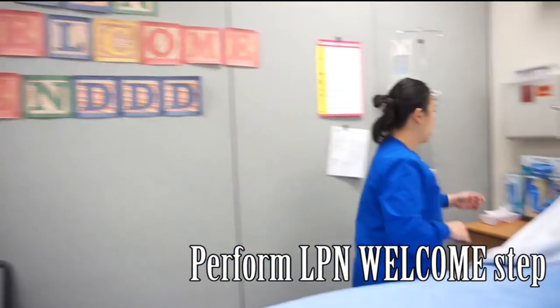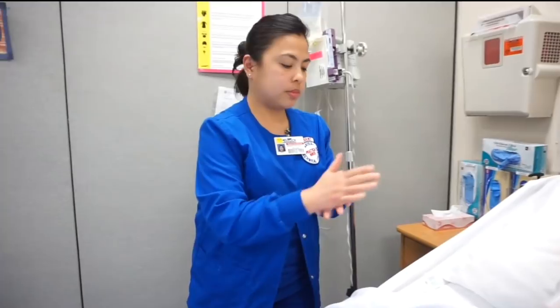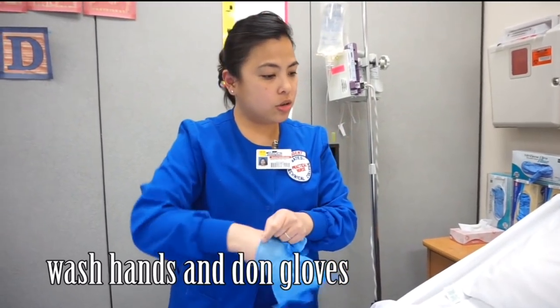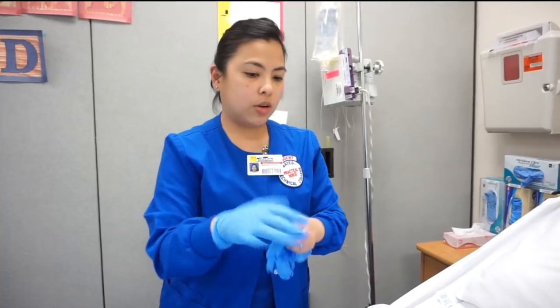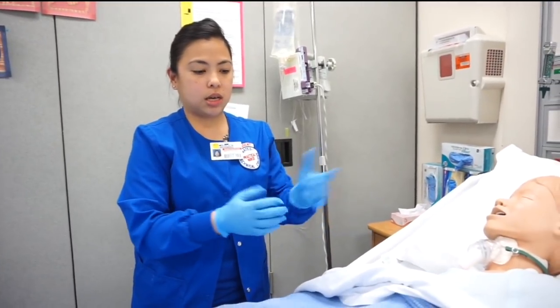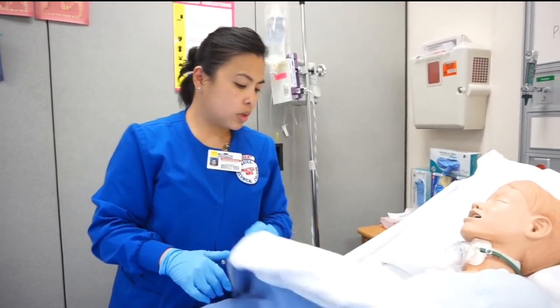I'm here today to do the G-tube irrigation and site care. First, I'm going to do my preparation work and enter the room to see my patient. I'm here today to irrigate the G-tube and do some site care.